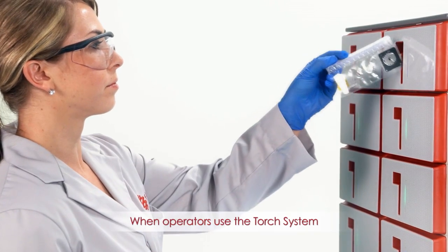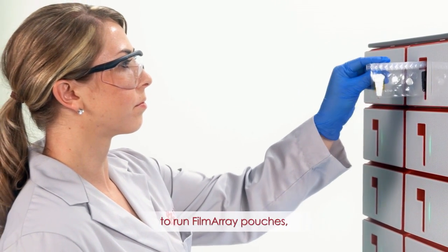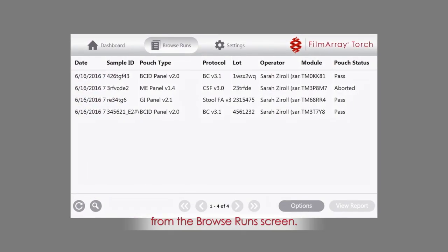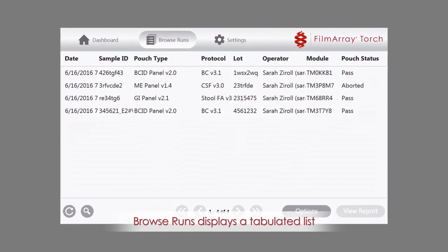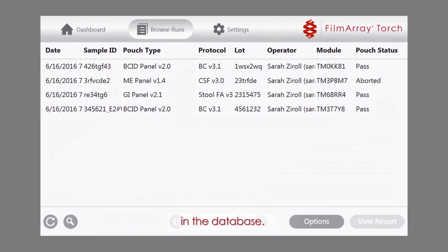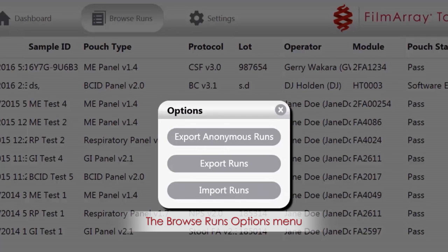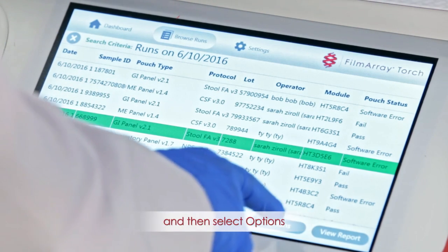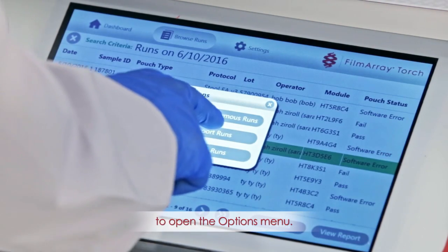When operators use the Torch system to run FilmArray pouches, data is stored in the local database and can be accessed from the Browse Runs screen. Browse Runs displays a tabulated list summarizing information about runs in the database. The Browse Runs Options menu also enables you to export anonymous runs, export runs, and import runs. To access these features, navigate to the Browse Runs screen, select one or more desired runs, and then select Options to open the Options menu.